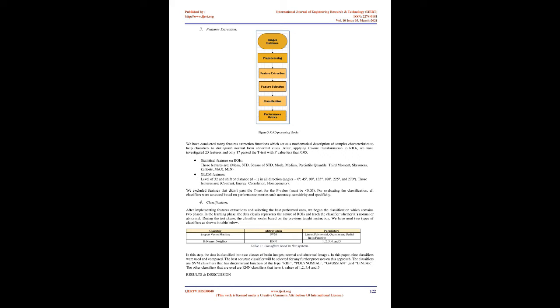Jayakandran and Ardana Skaran 13 suggested a hybrid algorithm for recognizing brain tumor in MR images. The proposed algorithm consists of pre-processing, segmentation, feature extraction, feature reduction and classification. In the pre-processing stage, the background noise and low frequency are removed. The segmentation of brain tissues is done by skull stripping and features are extracted using the gray level co-occurrence matrix, GLCM. The fuzzy-based support vector machine classifier, FSVM, classified the brain images into tumor or non-tumor with 94% accuracy.